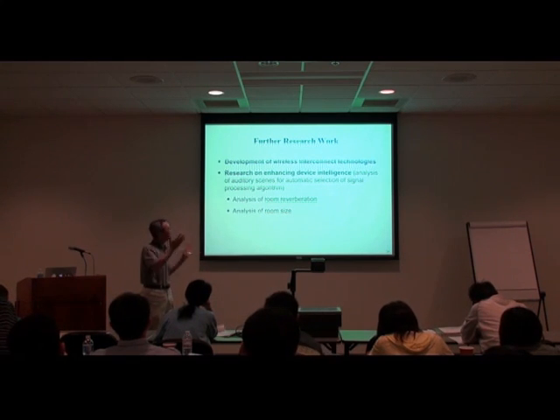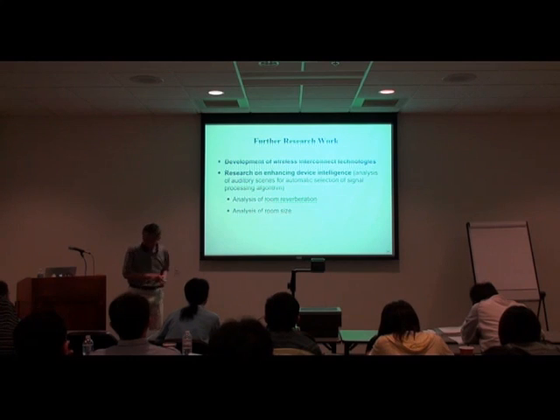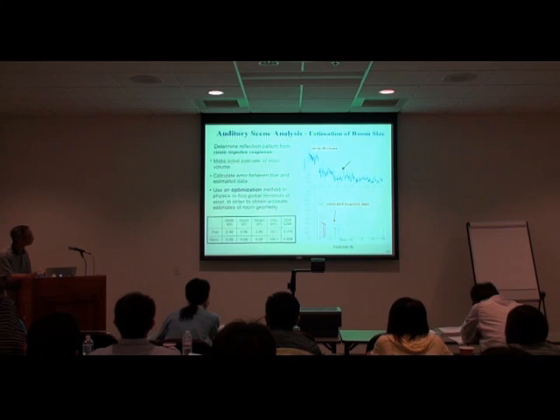But when you're talking in a complex environment with multiple talkers talking at the same time, you need to activate certain algorithms. And so we decided then to look at a way to analyze the room reverberation as well as analyze the room sizes.